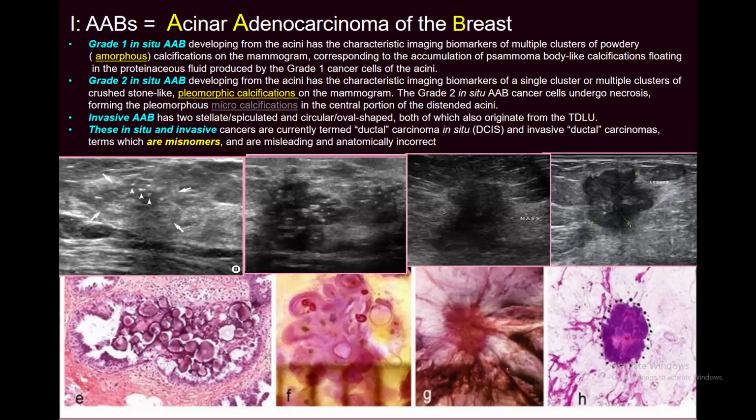And we used to discuss these things with our colleagues. I had one case before in Soba hospital where the patient had suspicious findings in one breast, and in the other breast she had just a small group of amorphous calcifications, concentrated on the left side, while to me the suspicion was more on the right side, the lesion I had seen.